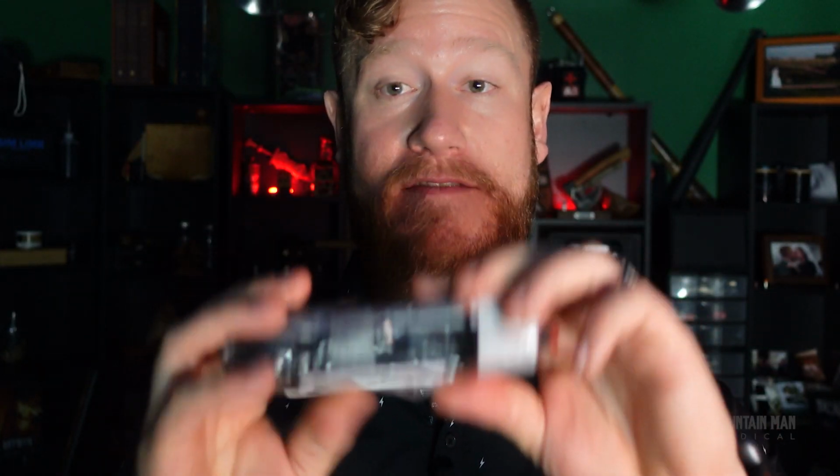Now, I'm having a little bit of difficulty getting into this, and my hands aren't even bloody. So make sure you're taking it out of the plastic before you stage this in your kit, so that you don't have to struggle with it like this, especially if your hands are slippery. I went through a whole bunch of effort trying to get this Recon tourniquet out of the packaging, and it turns out that the camera wasn't even recording, of course. So we missed that, but it was difficult to get this tourniquet out of the packaging. That's some pretty robust packaging.